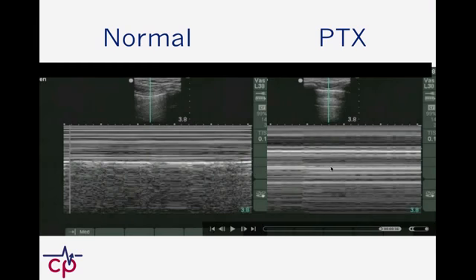So compare that to the pneumothorax. This guy has linearity top and bottom. You know, this is just waves everywhere. I'm lost at sea. And if you really want to know the mechanics behind why this happens, the best I can explain it is we're looking at movement over time. So if the chest wall is stationary with respect to the probe, and if you're doing a good job holding the probe on somebody's chest and stabilizing the probe with your hand against their chest, you're not going to see any kind of change in the data that you're seeing.